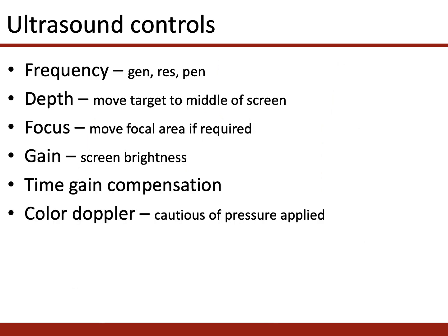Here we have the 6 main ultrasound controls that we should be familiar with. They are named slightly different things depending on the make of the ultrasound, but these are the controls that we need to adjust to optimize the image quality that we get. So we'll go through each of these in turn.